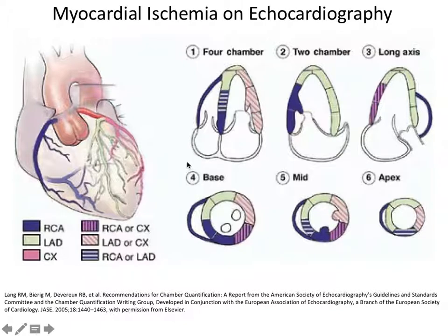And when they do that, they have in mind these regions, as we saw, the 2-chamber, 4-chamber, and the parasternal view, sample the long axis and sample the myocardium in different regions, and then the 3 short axis ones. Remember those 6 regions, 1, 2, 3, 4, 5, 6? The color scale here is the probability that that region is fed by a certain coronary artery.